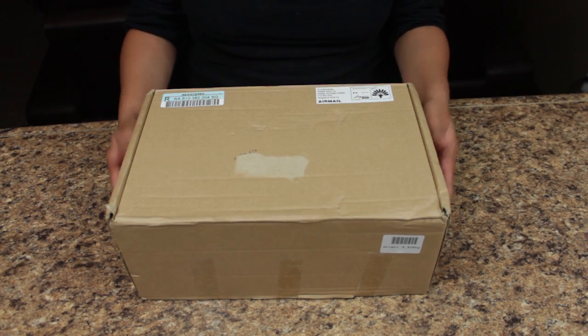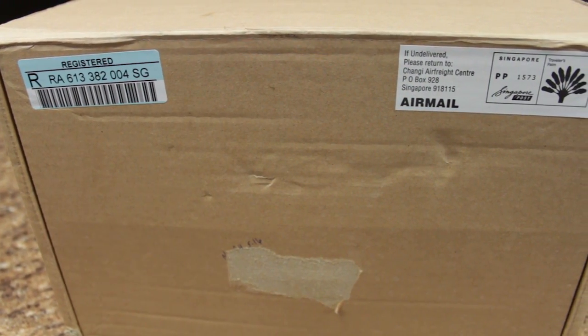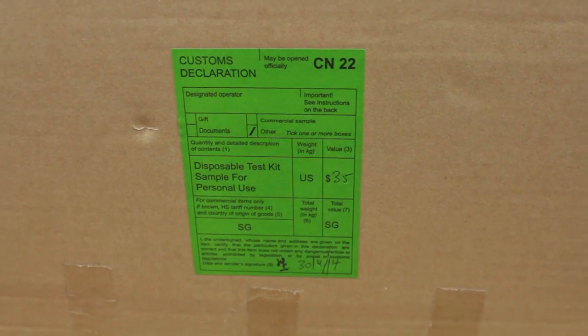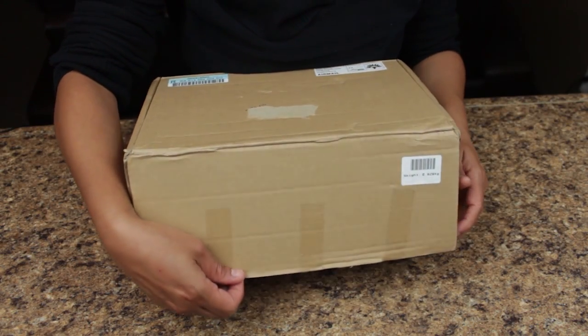Welcome to the demonstration video on how to use the iCare Syphilis Test Kit. As you can see, your package will arrive in a very plain, nondescript box with a very general description on the label to ensure your privacy at all times. Let's open it up and take a look.